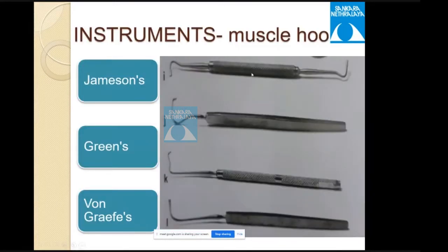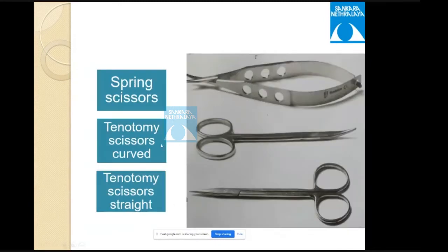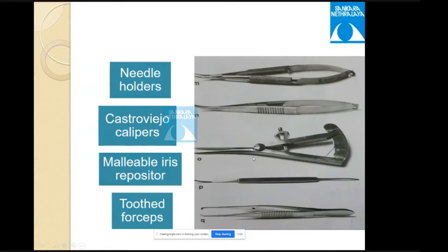Surgical instruments for squint surgery include muscle hooks: Jameson's hook (large, with bulbous end to fully secure the muscle), Green's hook (also large), and the von Graefe hook (without bulbous end, for lifting the muscle from sclera). The Stevens hook is a smaller hook. Other instruments include spring scissors, tenotomy scissors (curved and straight), Desmarres retractor, deep tissue retractors, muscle resection clamp, artery clamp, needle holders, Castroviejo caliper, malleable iris repositor, and toothed forceps.